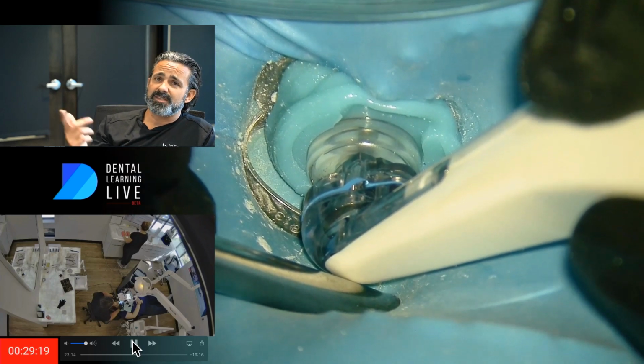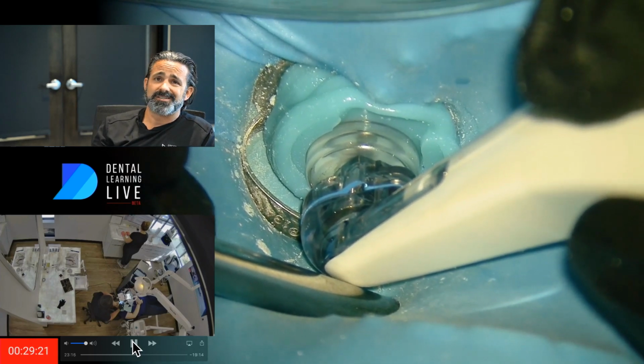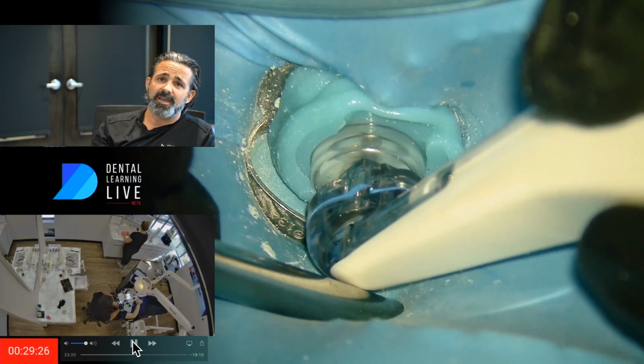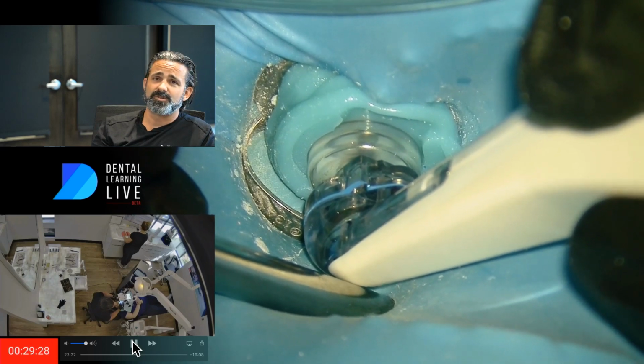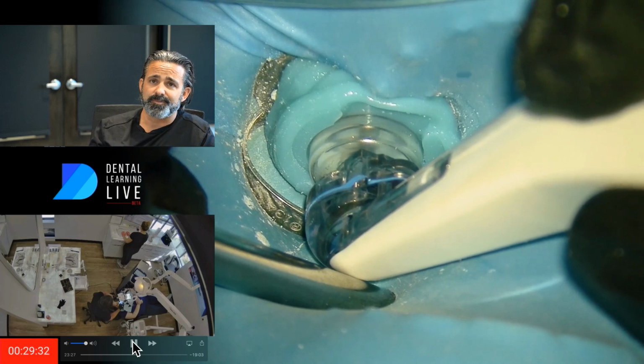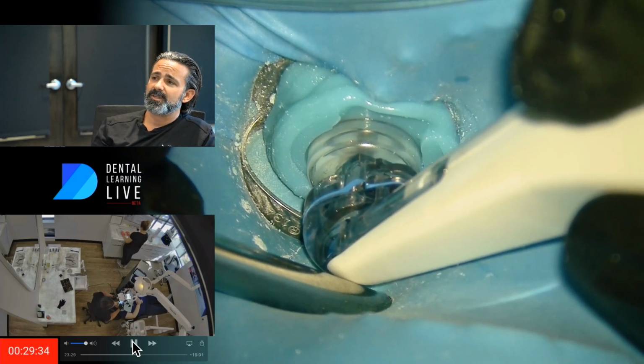I like using the mirror handle to keep that position, because it doesn't put a lot of pressure at that point. It also keeps the rubber dam off the head of the procedural instrument, so you can just observe if there's any fluid coming around or pooling around that your assistant can suction.